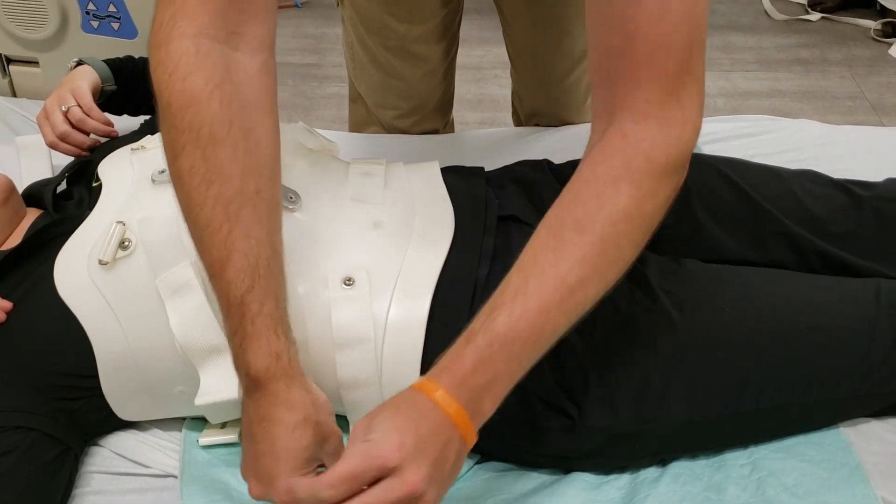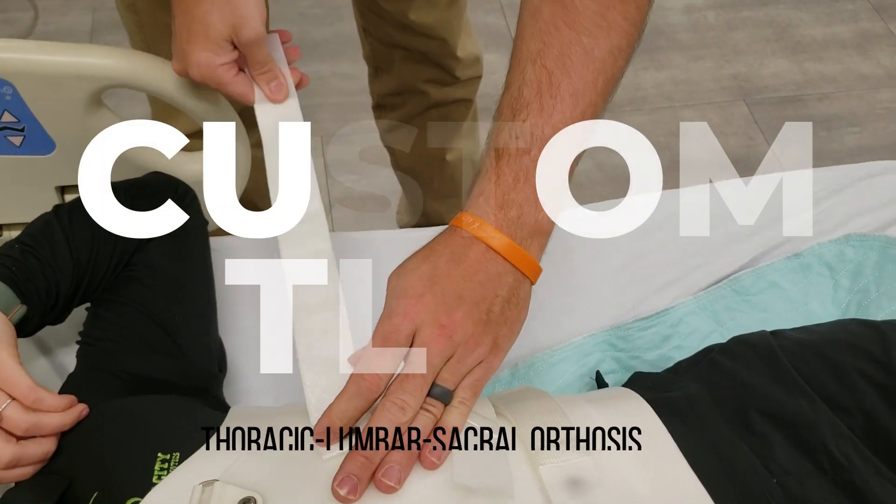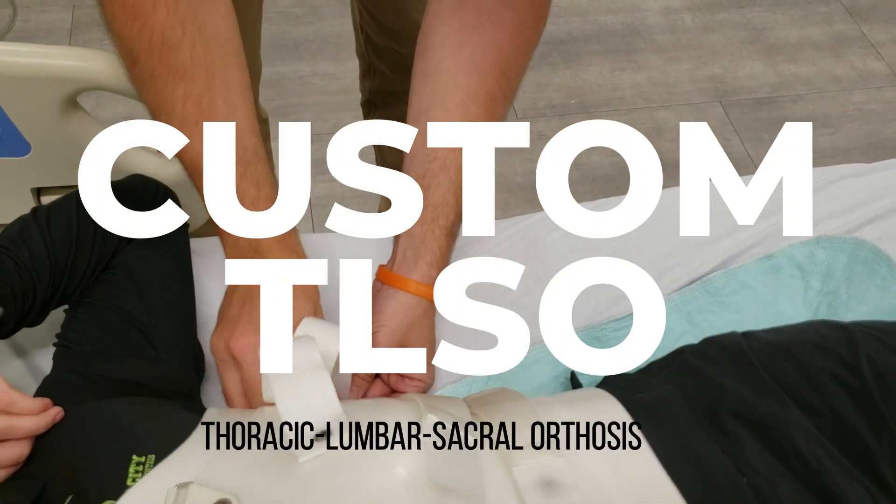In this video, the team at Summit City Prosthetics and Orthotics discuss the wear and care protocols of a custom TLSO.